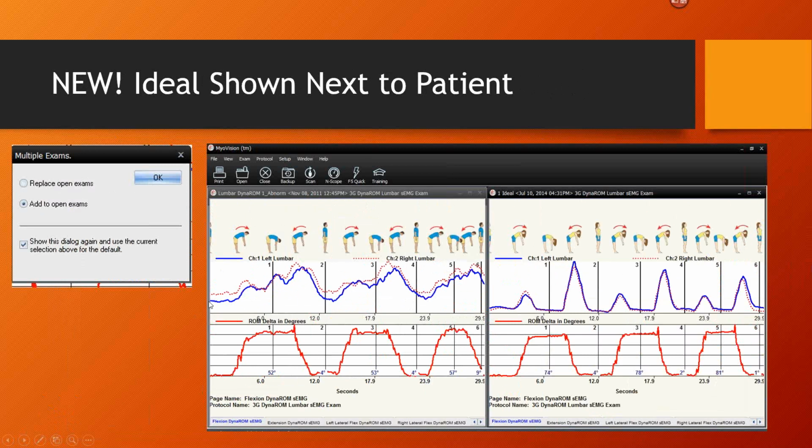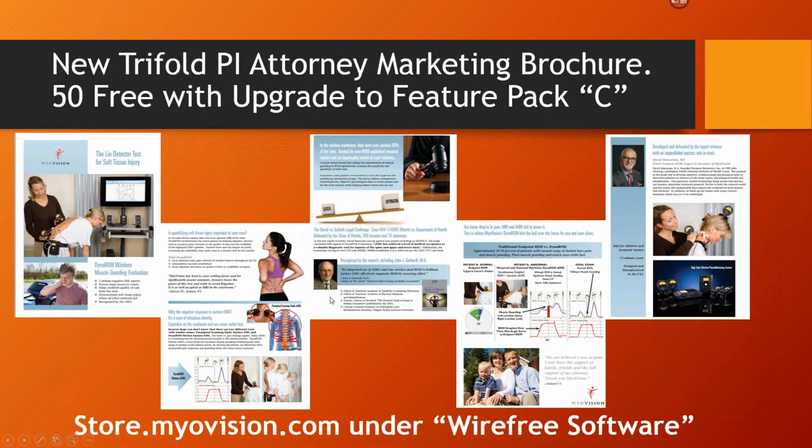It comes with Feature Pack C. You have to go to File, Import this, but that's done for you by Riley, whoever does the software setup for you, even though you can do it yourselves.